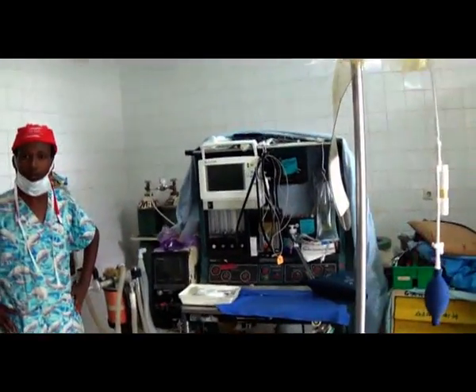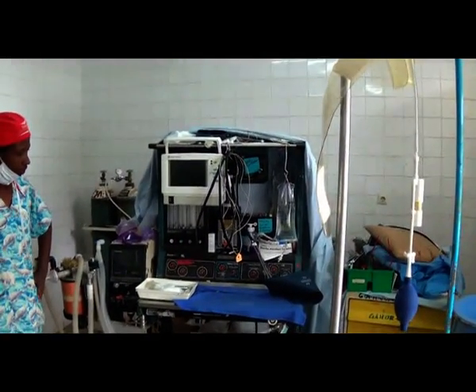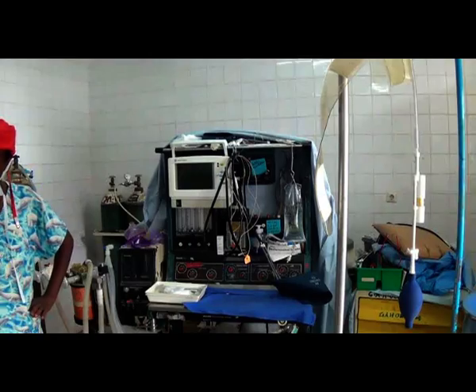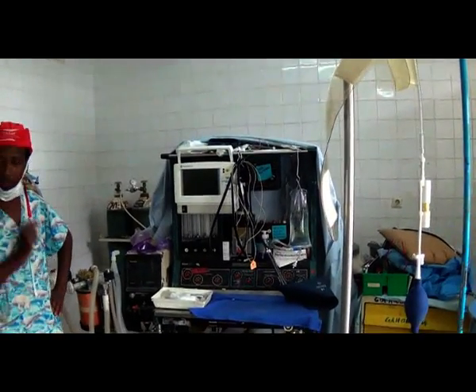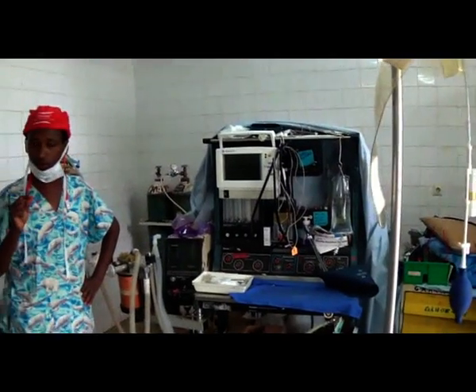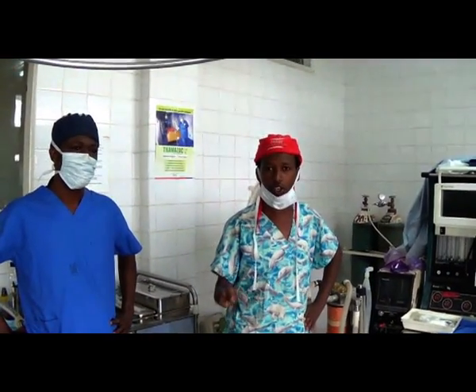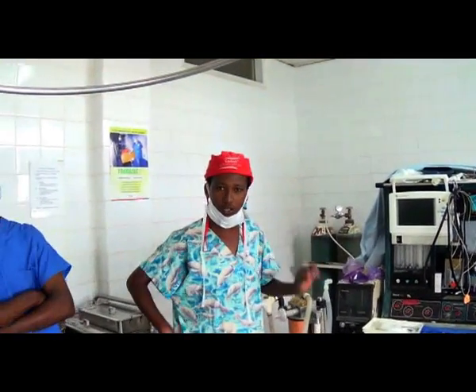Okay, for what purposes are you using this anesthesia machine? Actually, to standard, this anesthesia machine should be available for every operation, whether it is minor or major. It should be available and fully functional. I use it for patients who are going to take general anesthesia. That means total sedation, the patient put to sleep, relaxation. In such cases, it's a must-have.